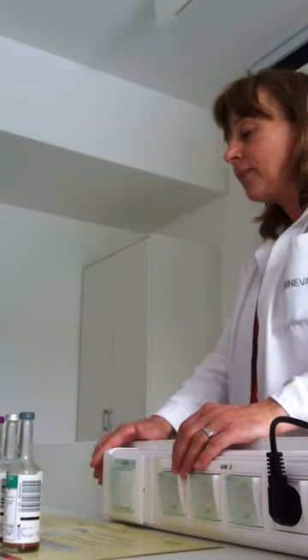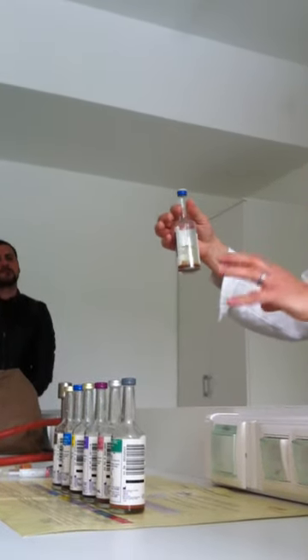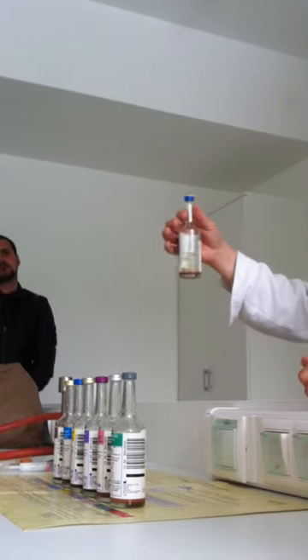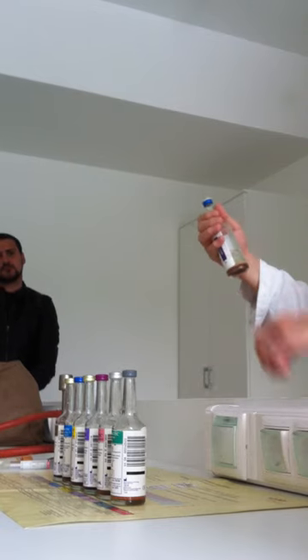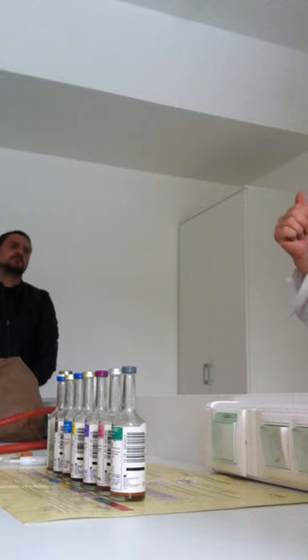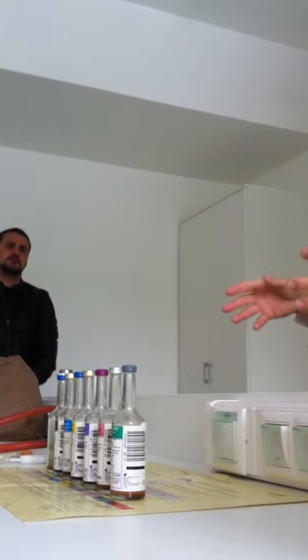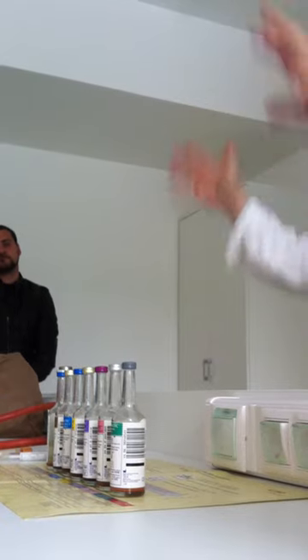Sometimes if you overfill, so the amount of blood is higher than appropriate, it could be a false positive. Why? Because there are many red blood cells, a huge number of red blood cells, which will shed carbon dioxide, and then it's a false positive sign for the equipment.